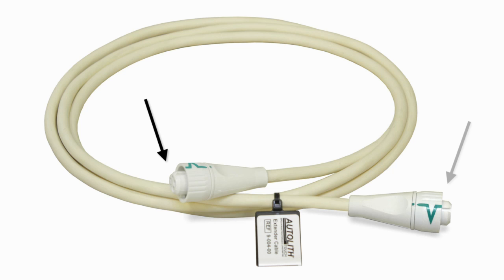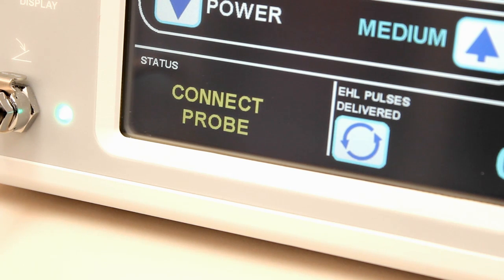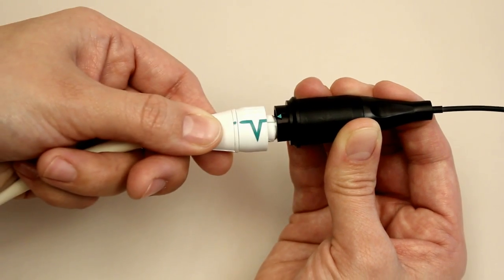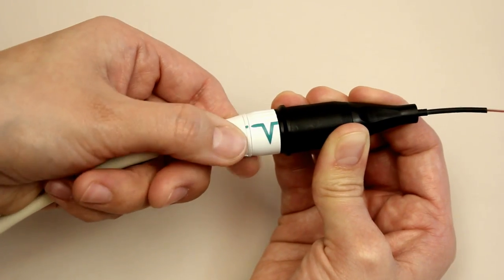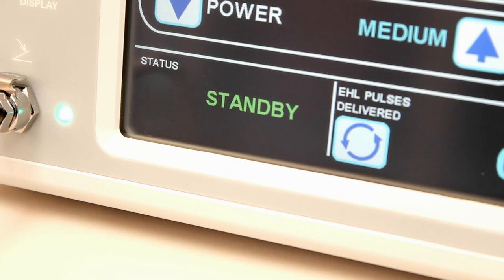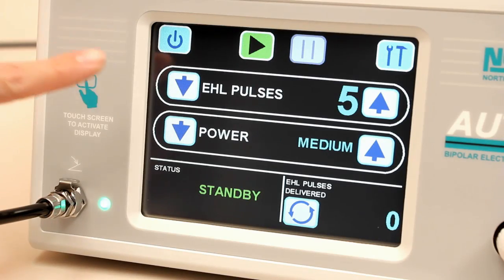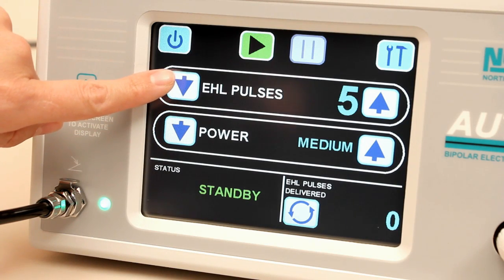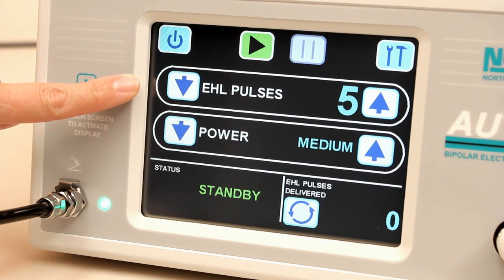Either end of the extender cable can be used when connecting it to the generator unit. The disposable probe can then be connected to the free end of the extender cable. Align the green lines and push the fittings together. The collar will lock them in place. Next, use the up and down arrows to select the number of pulses to be delivered per foot pedal depression, as well as the power value.